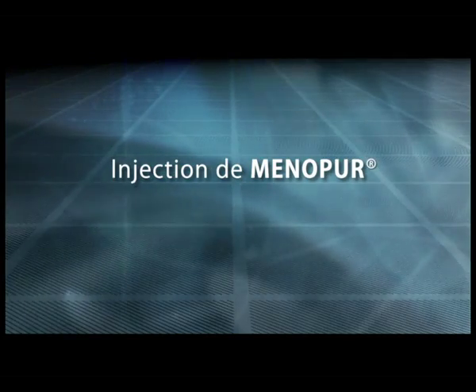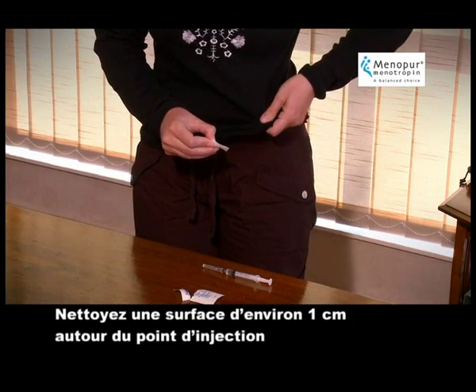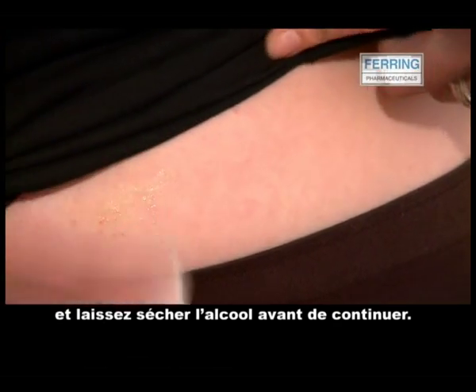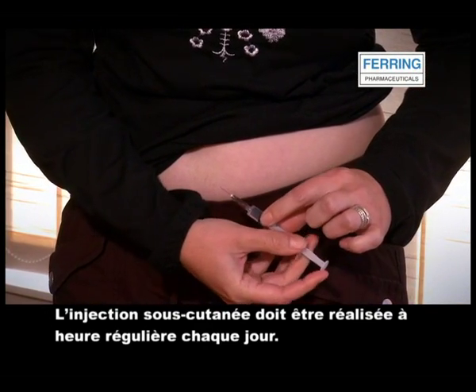The injection site should be swabbed with alcohol. Clean about 1 centimeter around the point where the needle will go in and let the alcohol dry before proceeding. The subcutaneous injection should be given at more or less the same time each day.